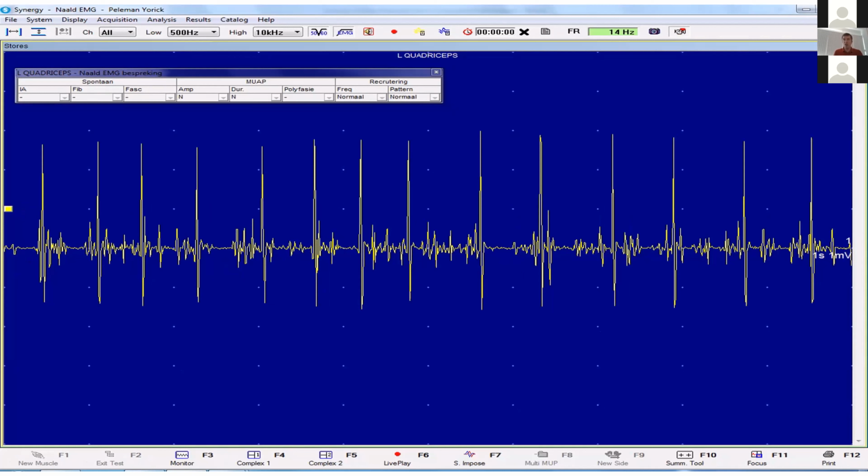Important during this qualitative myography is the sound of the sputtering motor unit when the same motor unit fires at higher rates. So we're going to watch the higher frequency, but we're going to listen as well to the higher sputtering sound of this motor unit.